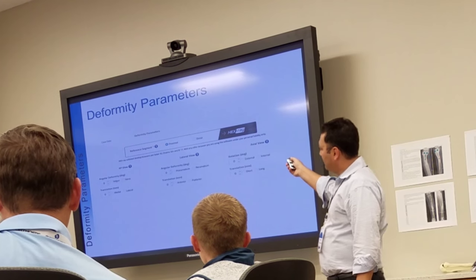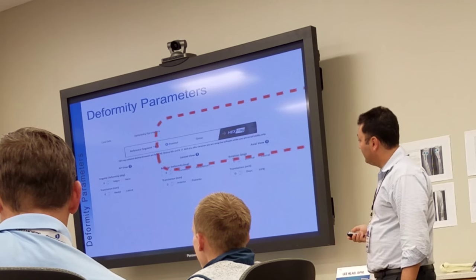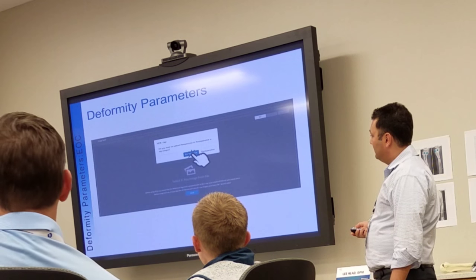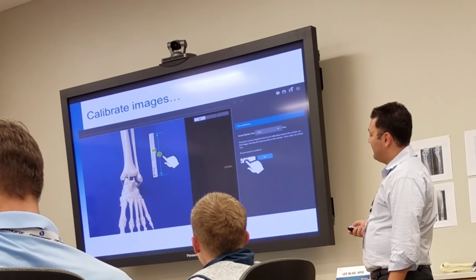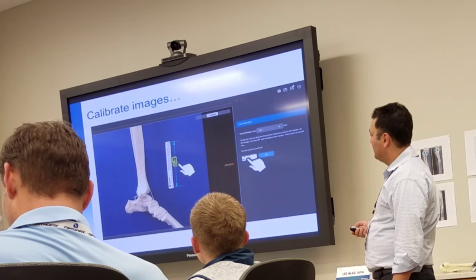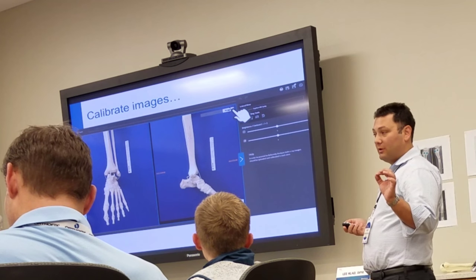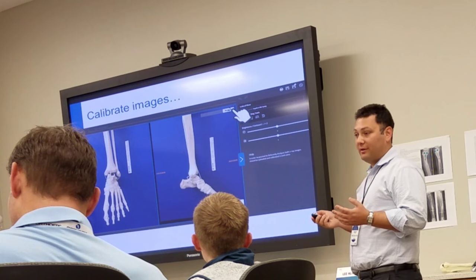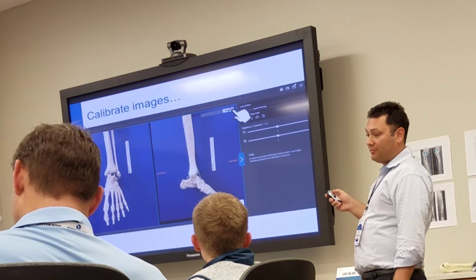You're going to click on the HexRay button and take your proximal reference fragment first. Do a pre-op. We're going to have to calibrate — just like on the last one, insert your marker and take a picture. In real life, you're going to need some sort of marker on the leg to calibrate off of if you're doing pre-operative planning.